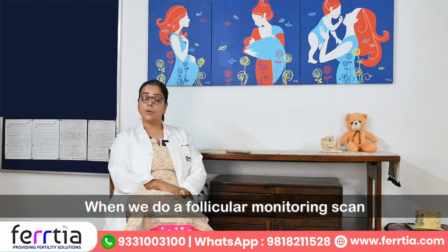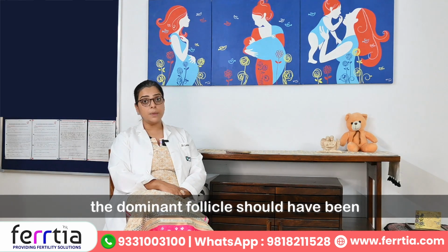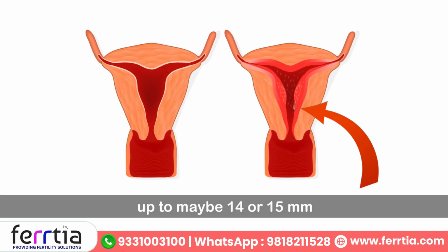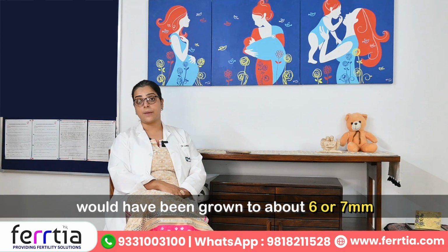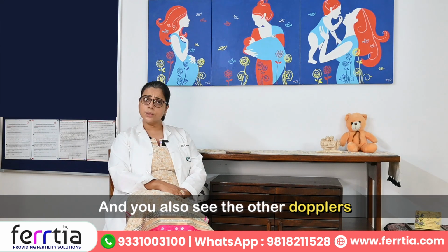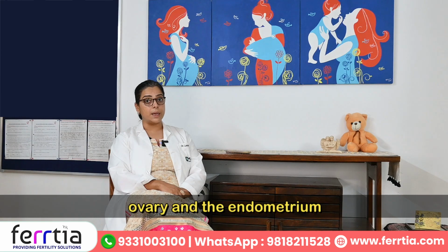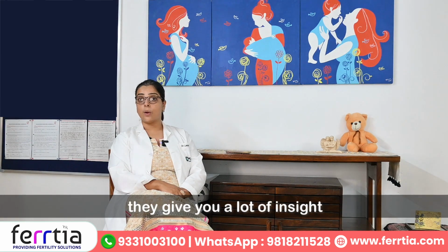When we do a follicular monitoring scan on day 11 of the menstrual cycle, the dominant follicle should have grown by that time up to maybe 14 or 15 mm. The endometrial thickness would have grown to about 6 or 7 mm, and you also see the other Dopplers and the other parameters around the ovary and the endometrium. So these follicular monitoring scans give you a lot of insight.